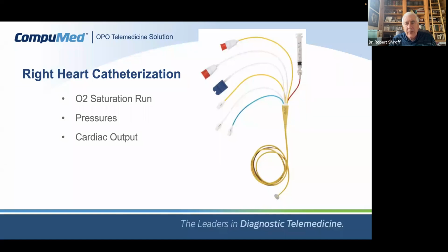They decided that it was really neat: if you put a balloon on the end of a catheter and could get it into a big enough vessel, it would float the way the blood flows, because there's movement of blood in a single direction in the vein. And they decided that was a clever idea. They also decided that it was a clever idea to measure temperature differences from one place.